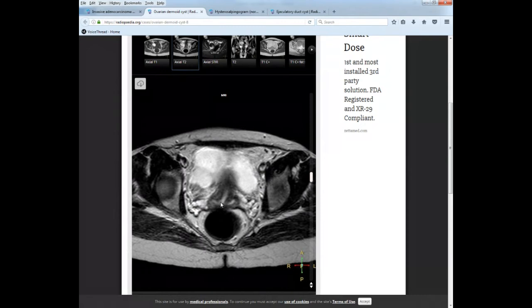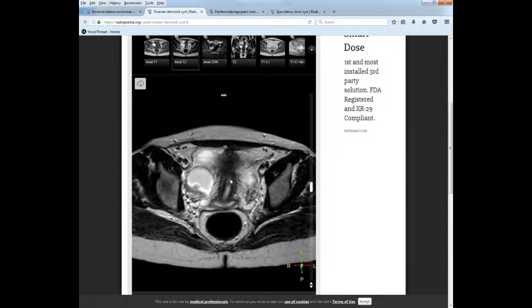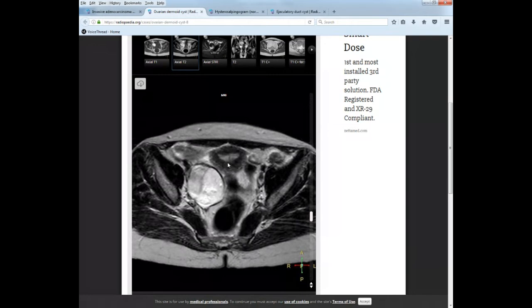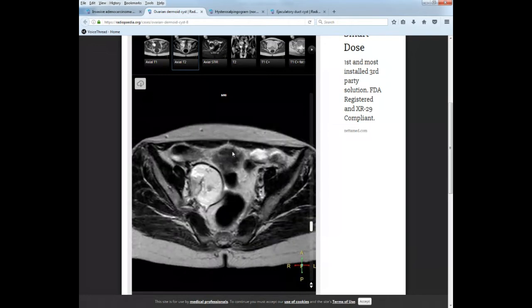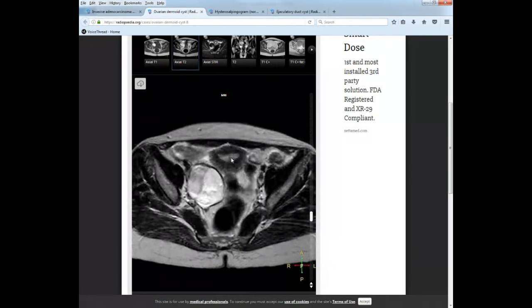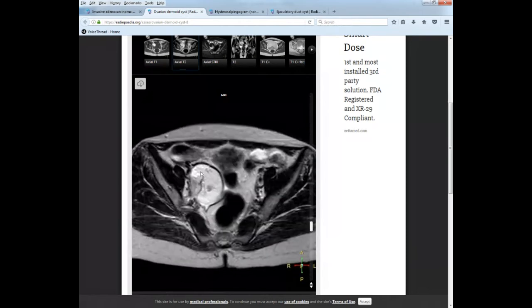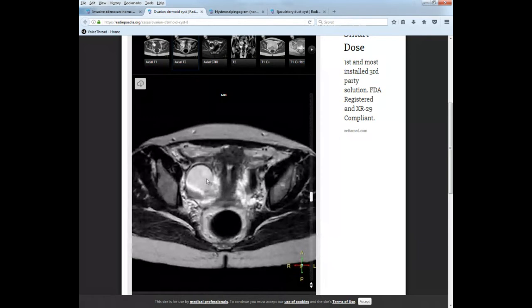And then remember, the uterus should be, in most females, although not all, anteverted. So it's going to be pear-shaped and it should point towards the front. This is the front. We should see it take a turn, and here it goes. Here's the uterine cavity taking a turn towards the front. And remember, we're also traveling superior, so we're going up. We're now into the fundus of the uterus. So here's the fundus of the uterus right here. Here is your left ovary, and here is your right ovary over here, which also has this huge cyst associated with it.